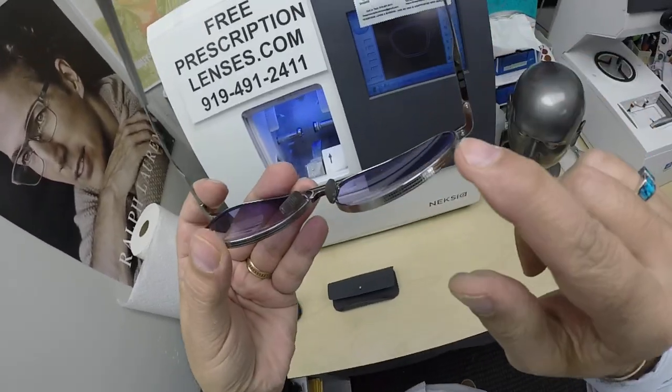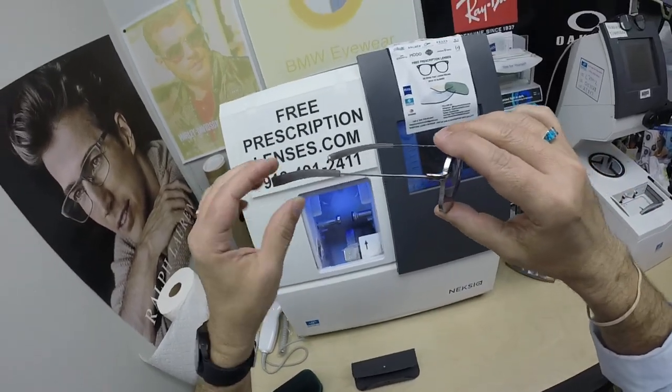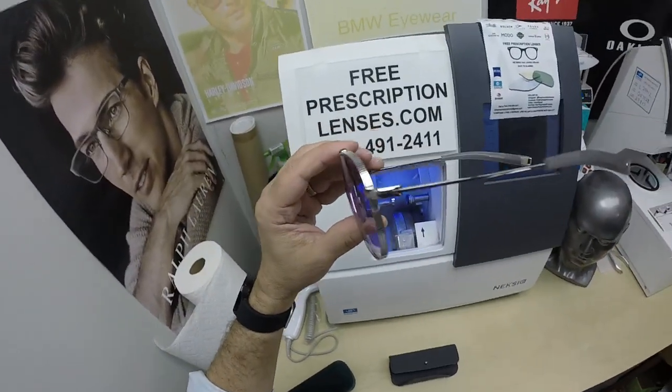The Lancer. I love this detailed engraving on the frame. But you don't have to buy frames from me — I can do lenses only for your frames. This is a really, really nice Dita, but then again, Dita doesn't make junk.